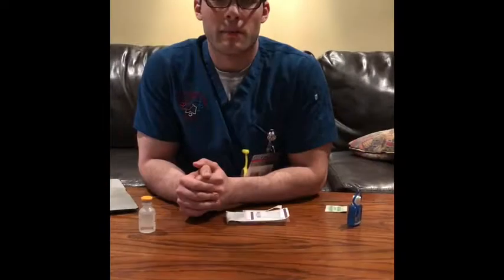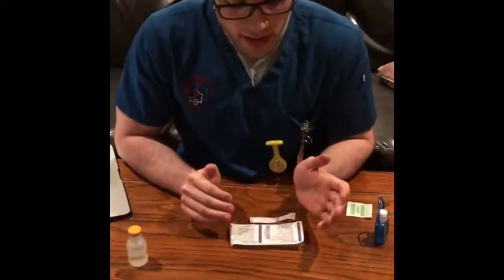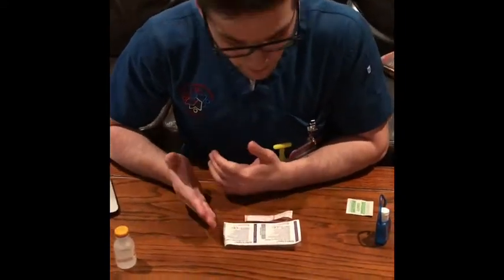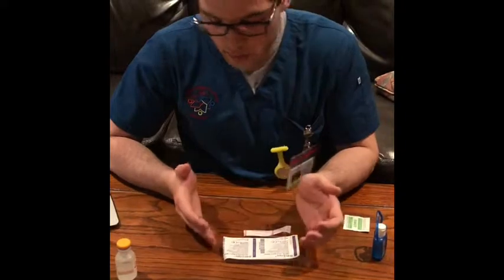So we're going to begin by preparing the subcutaneous injection. We can start by administering some hand hygiene. And then from there we can compare the needle and the medication to the MAR and make sure that the medication makes sense for the patient's condition, as well as the needle being used makes sense for subcutaneous injection. So it's a 25 gauge, which is within the range, and the range is 1 to 3 milliliters for a subcutaneous injection, and this one is 1 milliliter.